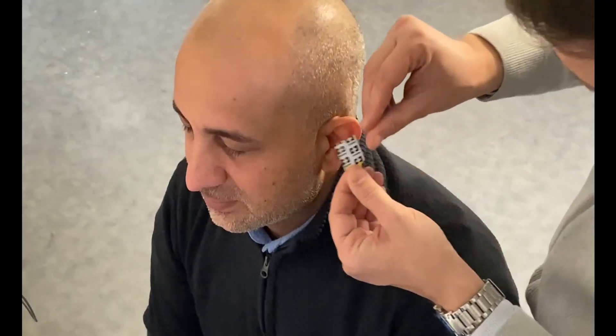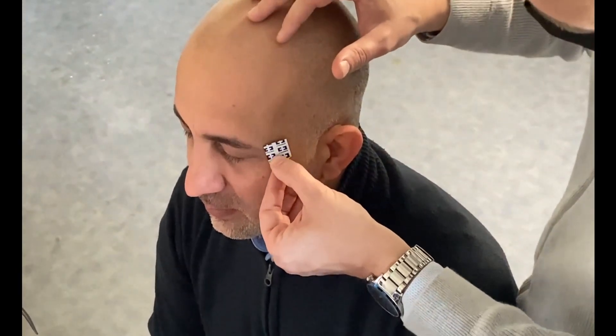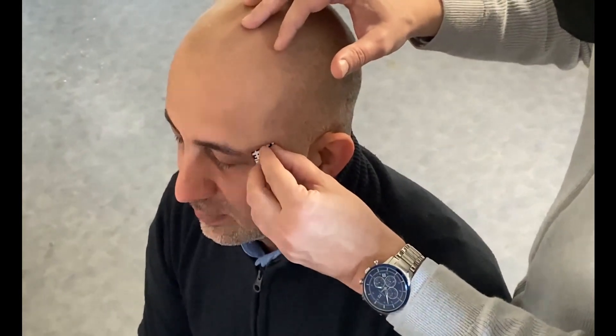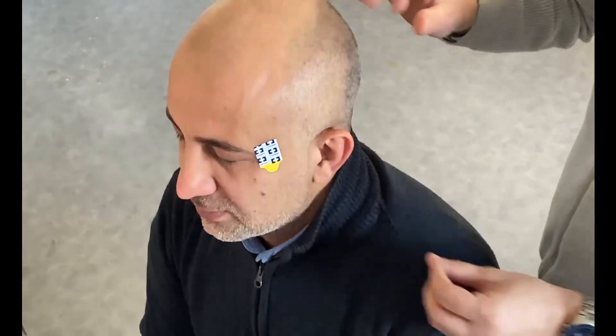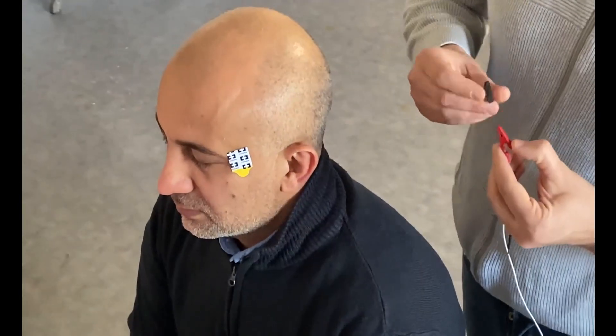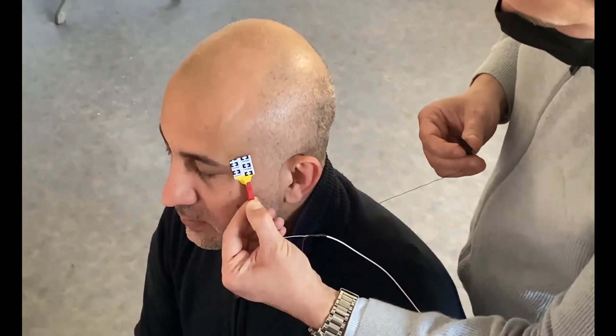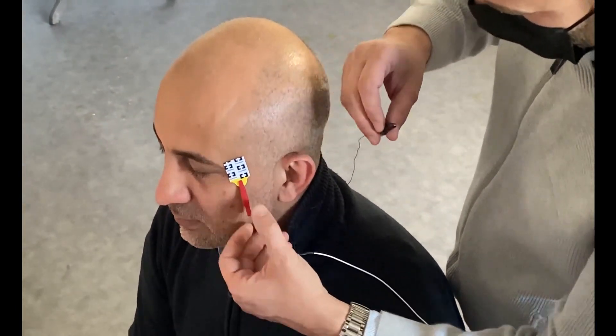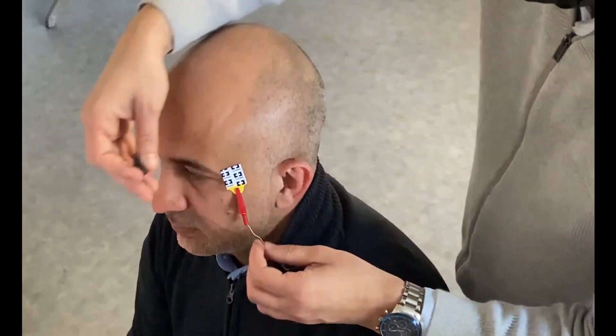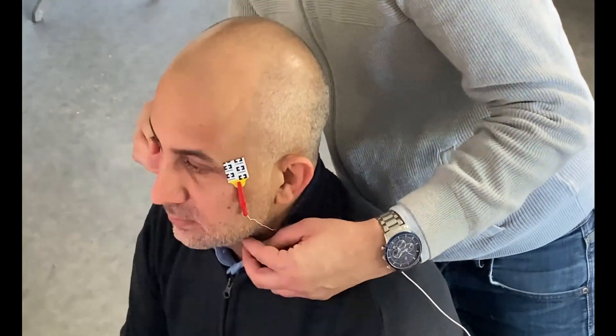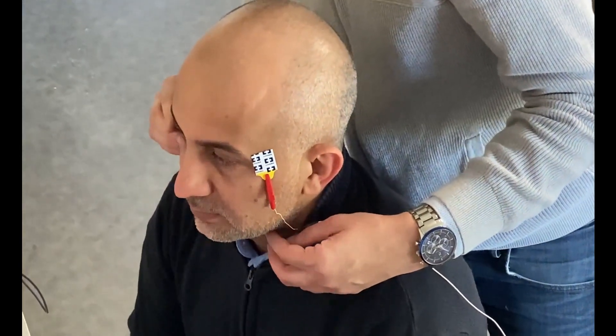We can use different electrodes as reference. Here we will use a pre-gelified patch. We now connect the reference electrode to the negative input of the amplifier and the neutral electrode which is on the other side of the head.